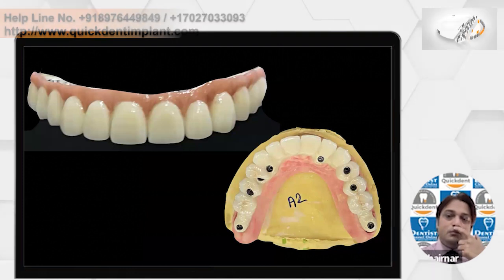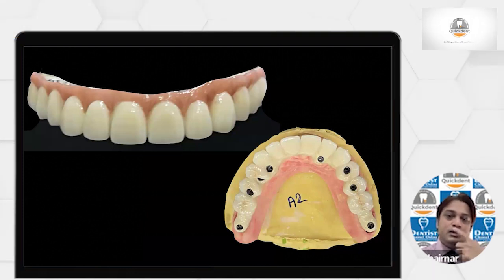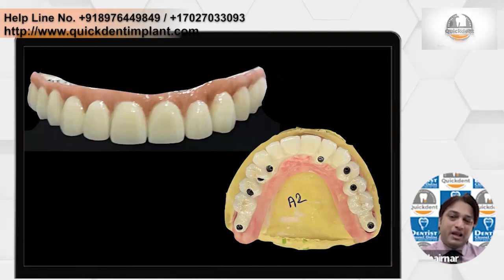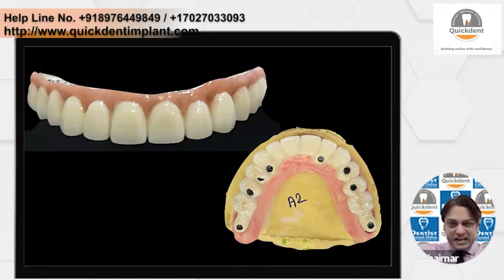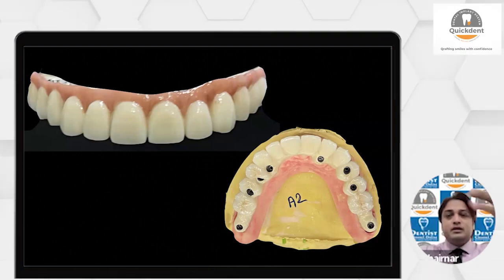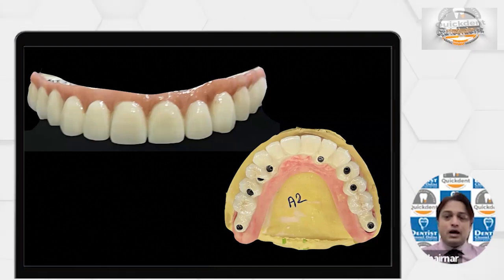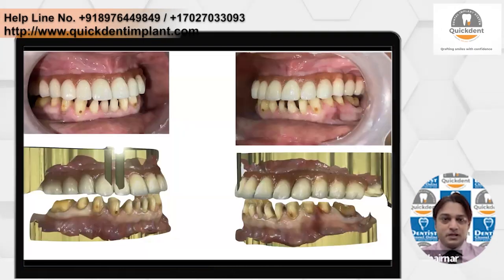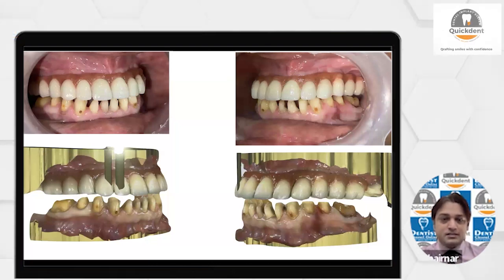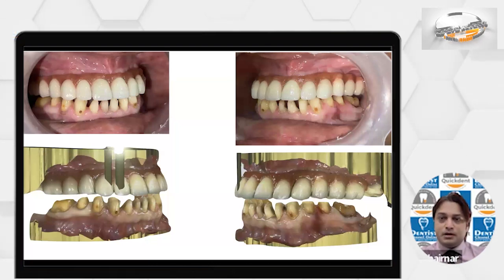So we added a little more thickness, because see the bone loss, because of the bone loss, the bone is located quite more palatally, because the maxilla shrinks inside. That's why the bone is there and the teeth position is comparatively outside. So that's why we had to add little more bulk on the cervical aspect, so that her lips don't get dropped. And this is the bite of the patient, upper and lower.